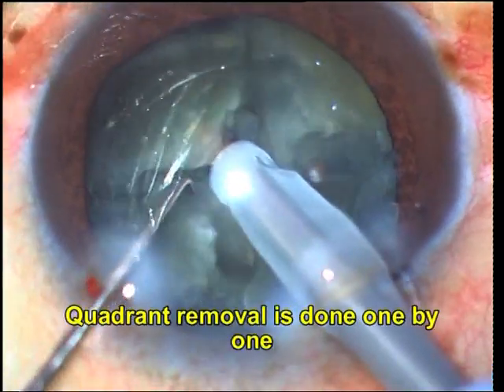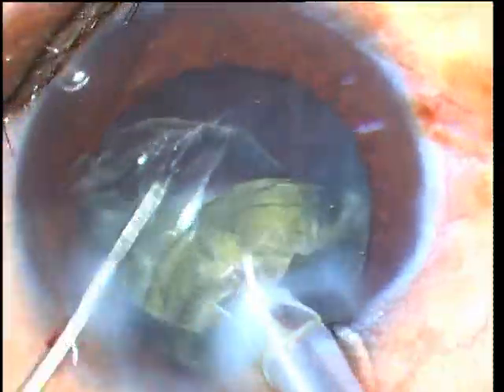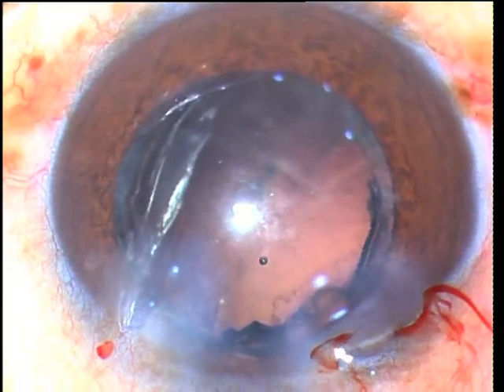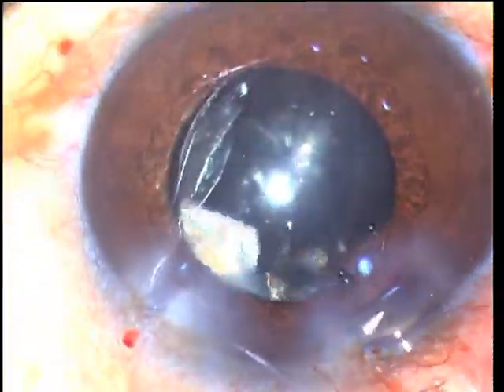Each quadrant is then embedded at mid-depth and brought out one by one to be emulsified at the iris plane. As the quadrants fit together like a jigsaw puzzle, the first one is the most difficult to bring out. But once the first has been brought out, subsequent quadrants can easily be brought out into the anterior chamber to be emulsified.